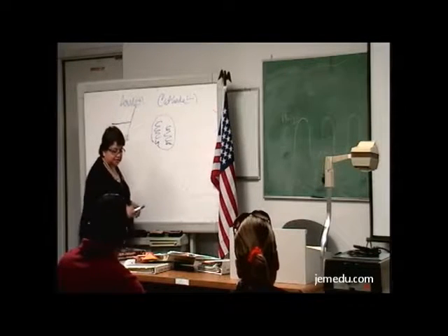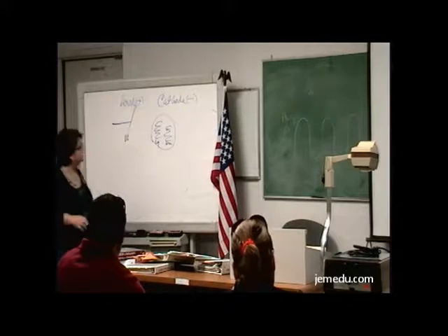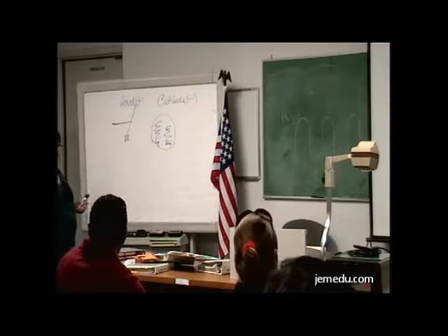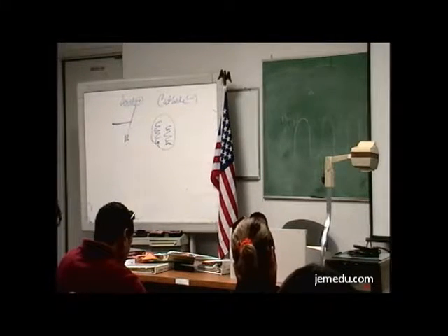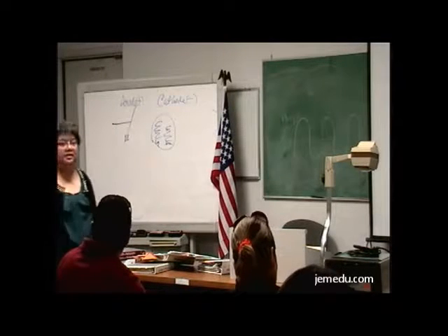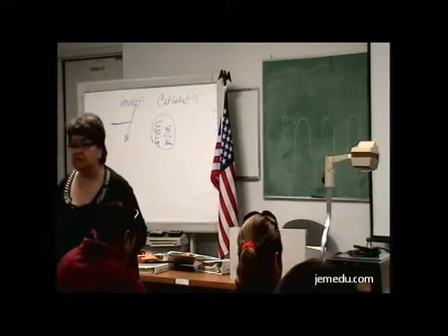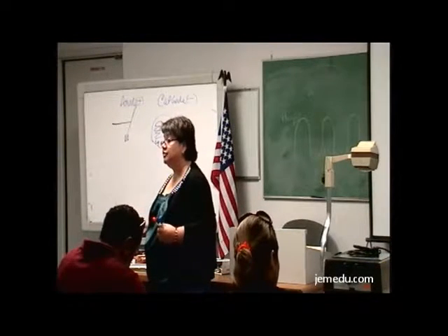Okay, now tell me about the filaments. What's going on with these filament thingies? They heat up. What are they made of? Tungsten. We use tungsten. Why do we use tungsten? High melting point. Okay, you're going to see this question. The filament is made of tungsten because it's going to get hot, so we need something that's able to withstand that heat.